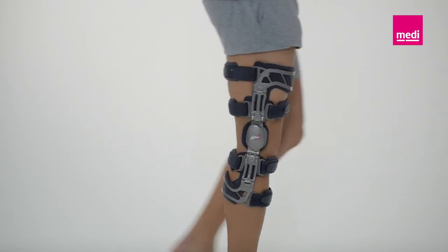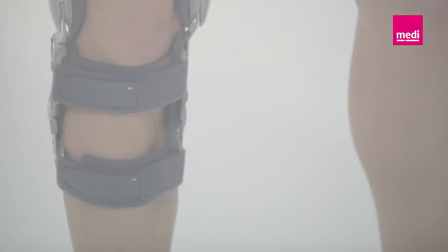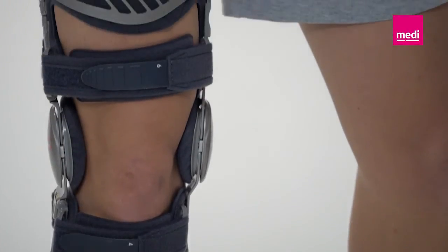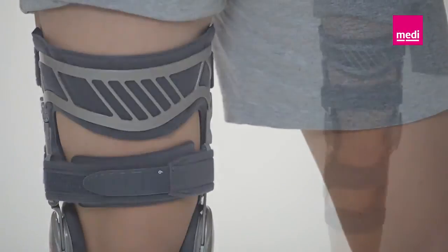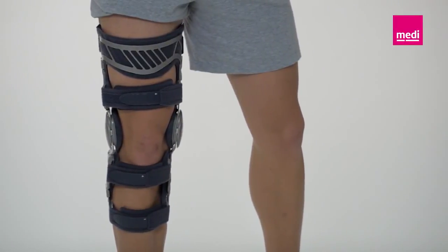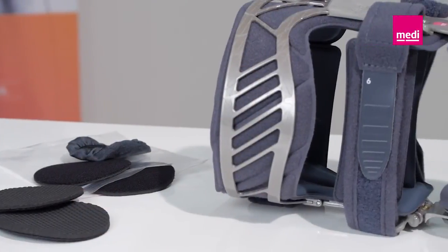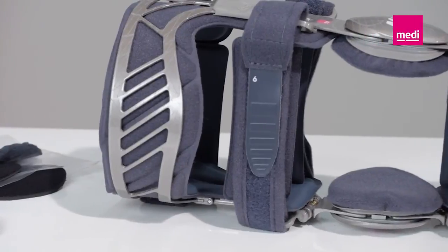For post-operative treatment, the orthosis should always be worn whenever the knee is weight-bearing. However, always consult the attending doctor about this. Please note that extreme settings have no therapeutic value — they simply cause more pain. The inner pads and condyle pads can be washed by hand in cold water and a mild soap solution. Leave them to dry in the air.